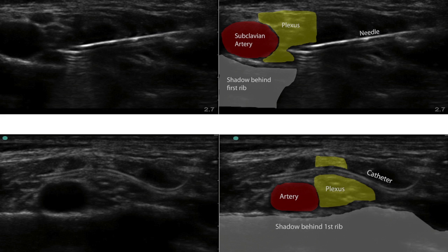Catheters can easily be placed using the supraclavicular technique. We're going to discuss that in a subsequent video, so look at the list of videos available for the supraclavicular catheter technique.